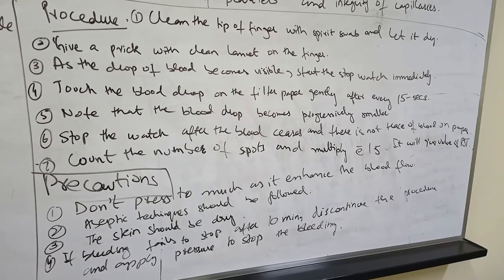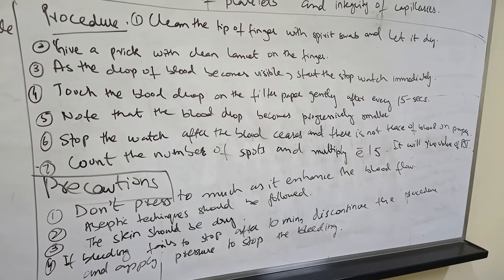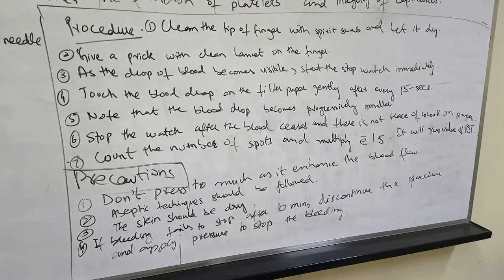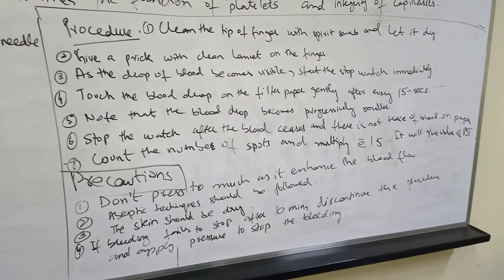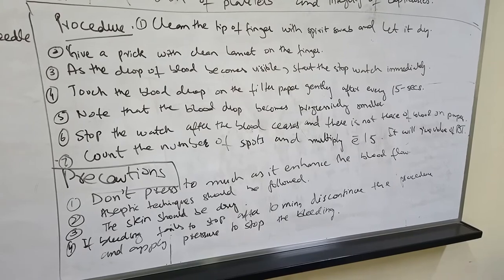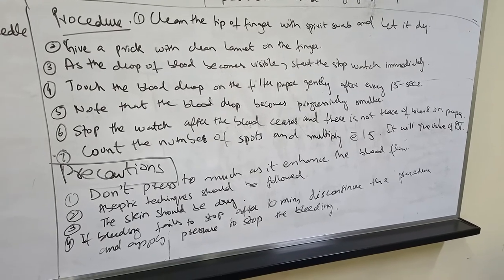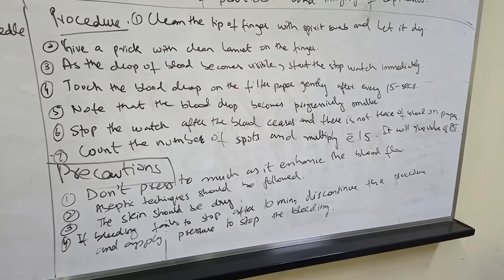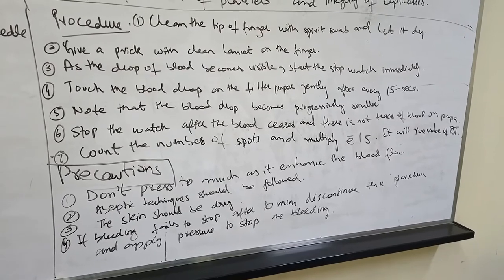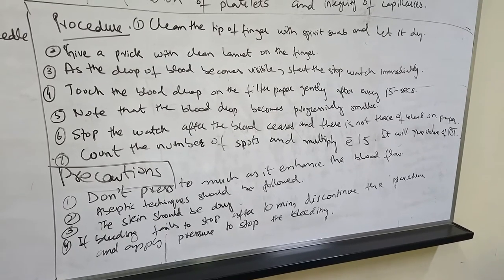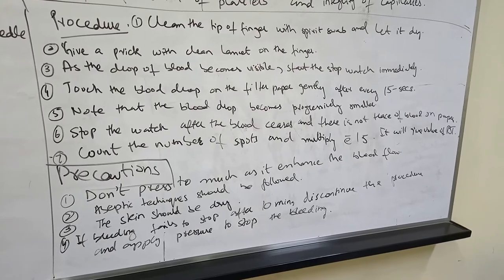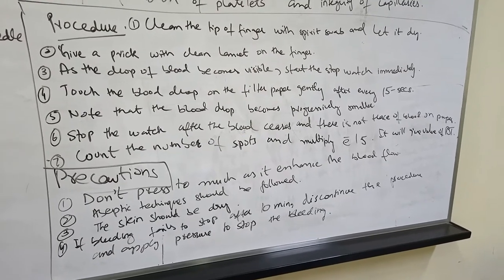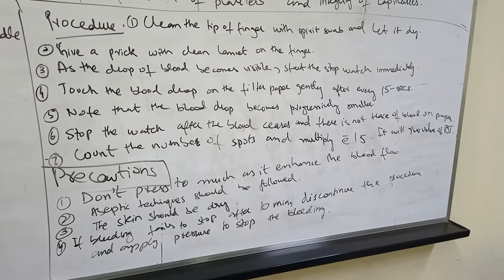Apply a drop of blood on the filter paper after every 15 seconds. Note that the blood drop becomes progressively smaller. Stop the watch after the blood ceases and there is no trace of blood on the paper. Count the number of spots and multiply by 15 — this will give you the value of bleeding time.